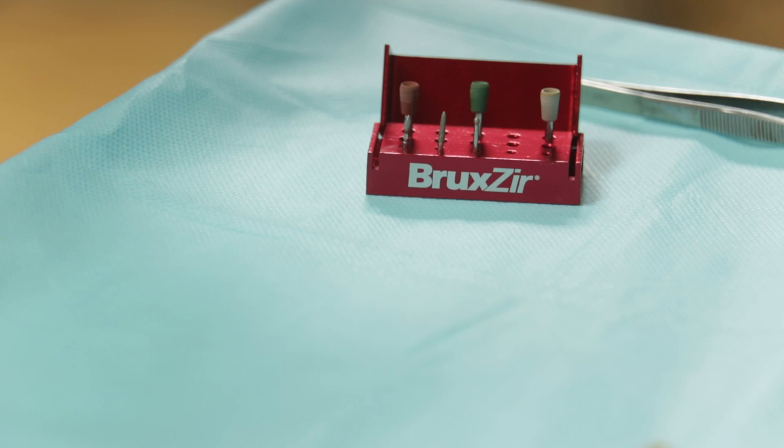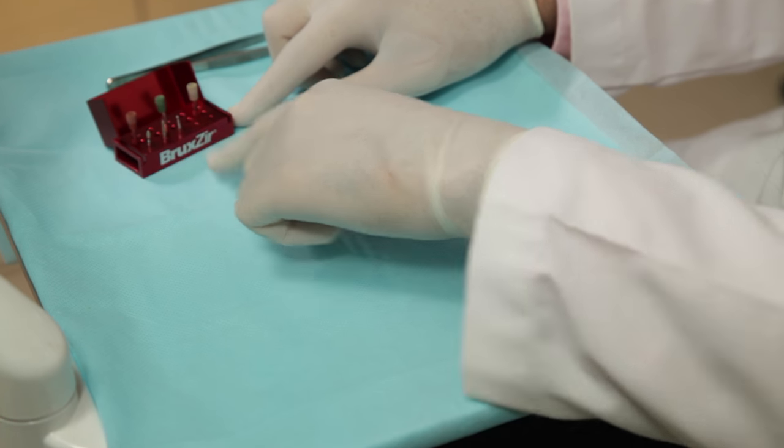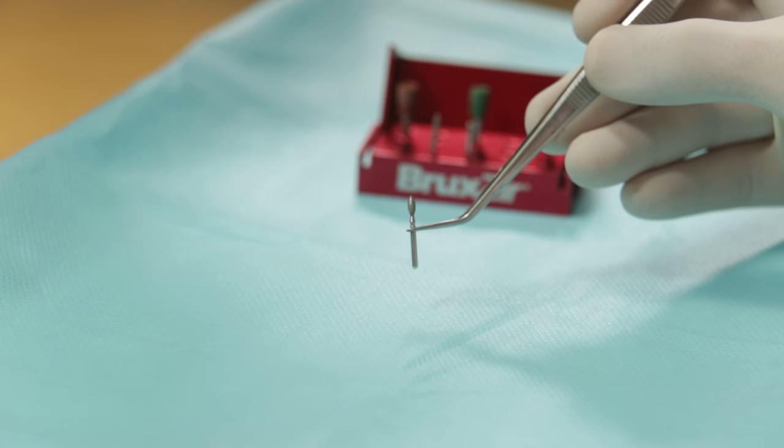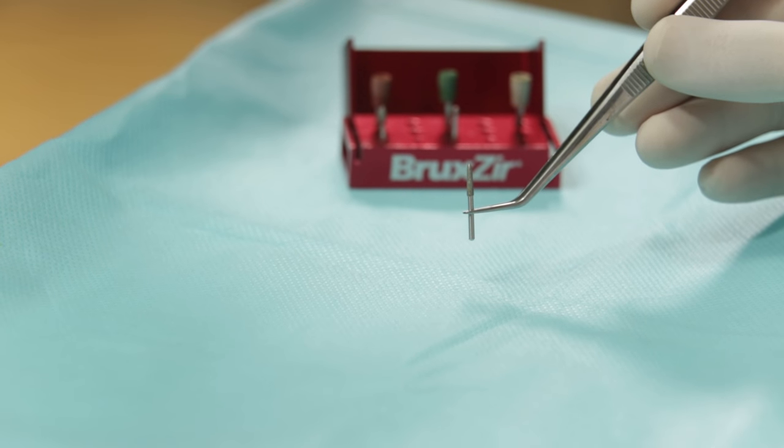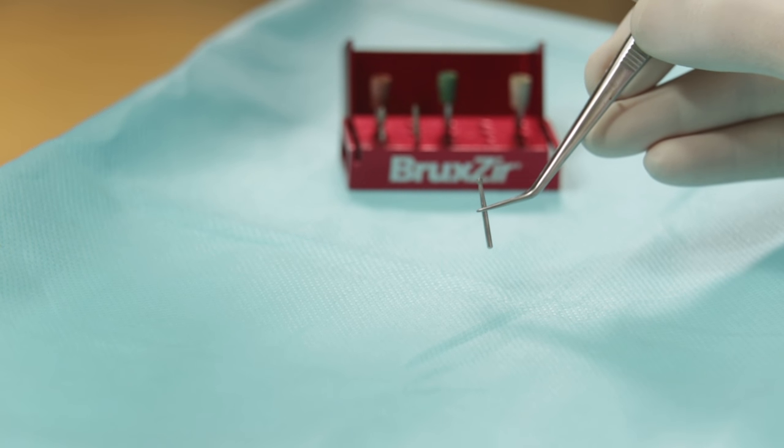So let's take a closer look at the Bruxzir adjustment and polishing kit and how to use it. As you can see here, I have three diamond burs with me which are of different shapes. The flame shape bur is excellent for use on occlusal surfaces, whereas the tapered bur is great for the proximal area. The round bur can be used for adjusting a cusp tip or a fossa.